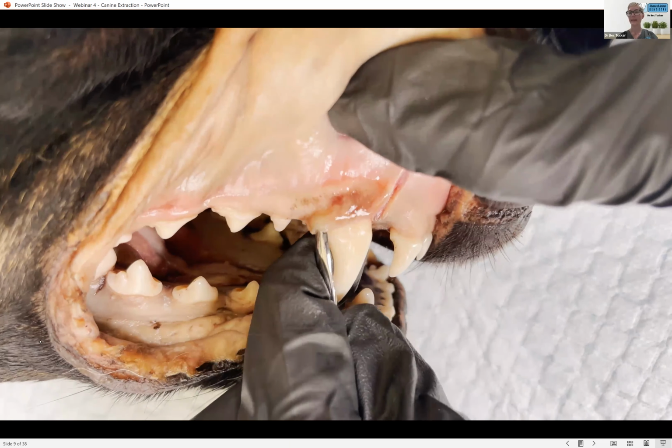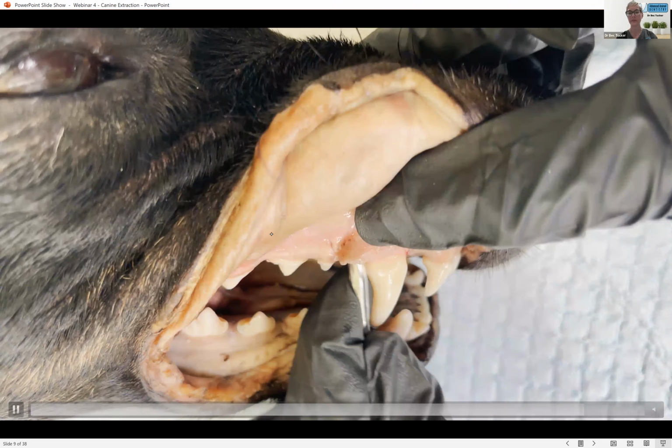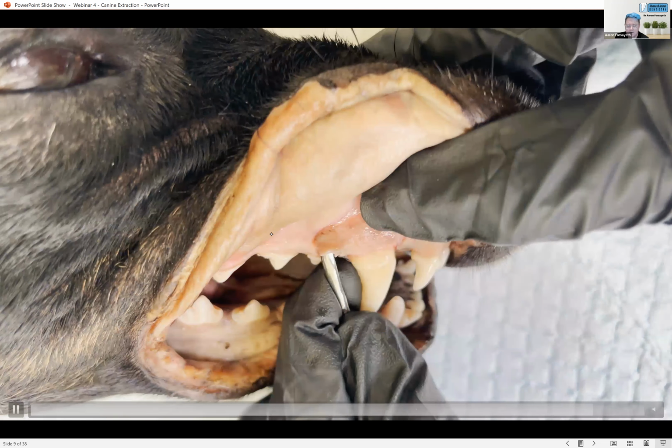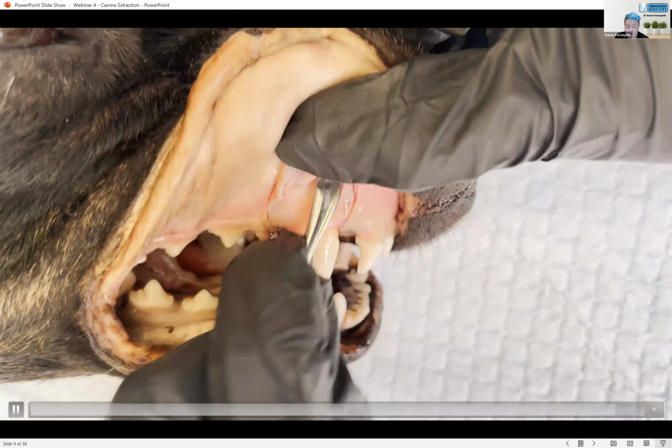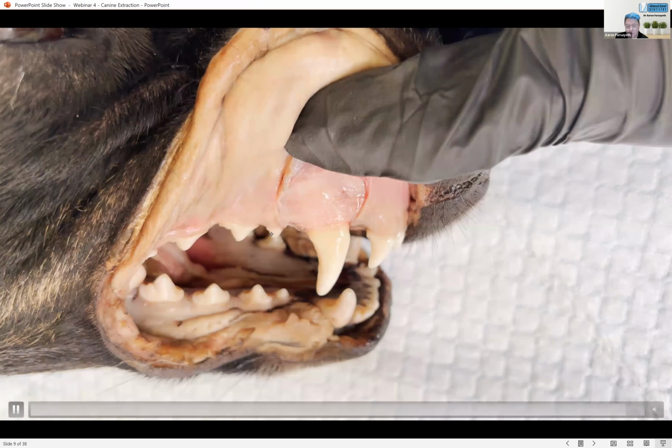But if you need a little bit more at this stage, that's when I'll make that little extra incision vertically. And I don't make it as long as the rostral or mesial incision. It's really just the level of the attached gingiva to the mucogingival line, and that gives plenty for us. Again, if you need to do more, you can extend it back over the first and second premolar at that mucogingival line if you need to. You can always do more with these things. And can you go too far? You can go too far, but you've got quite a distance to go before it's too far.